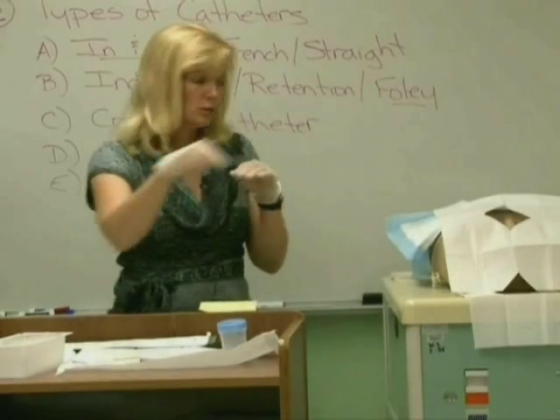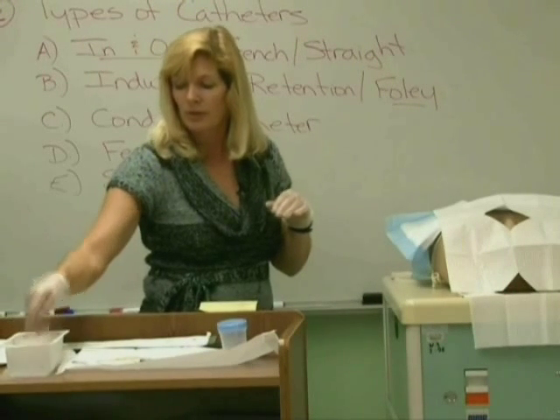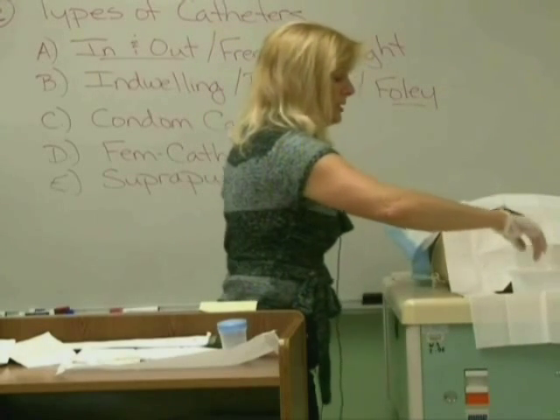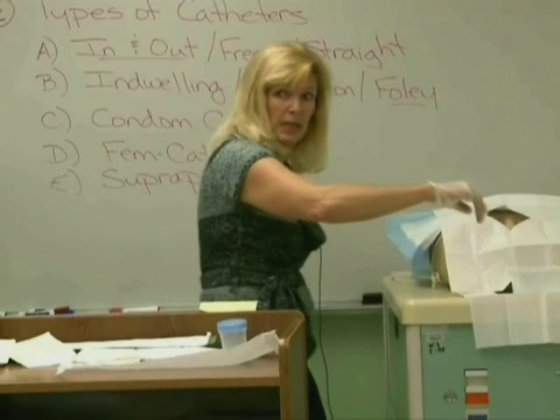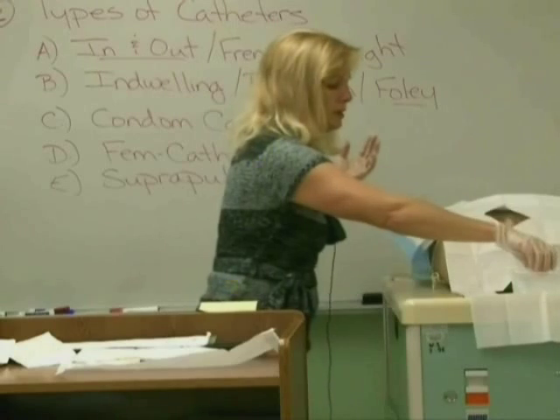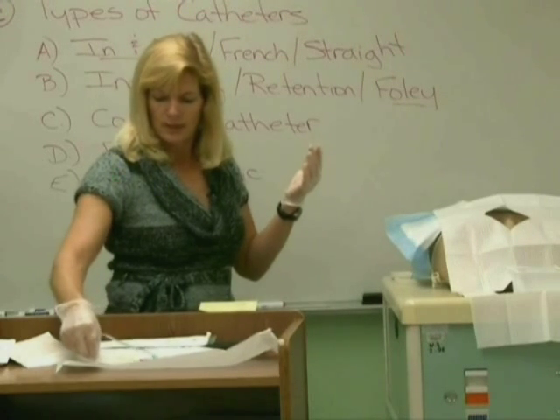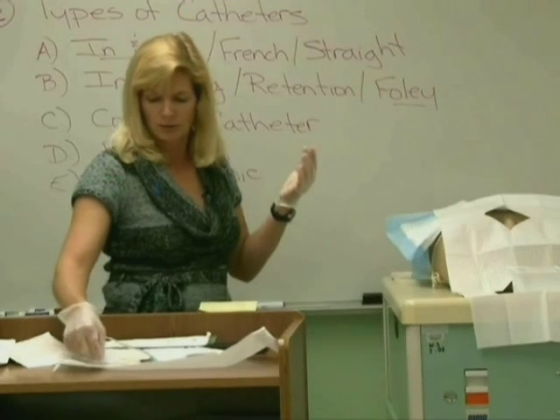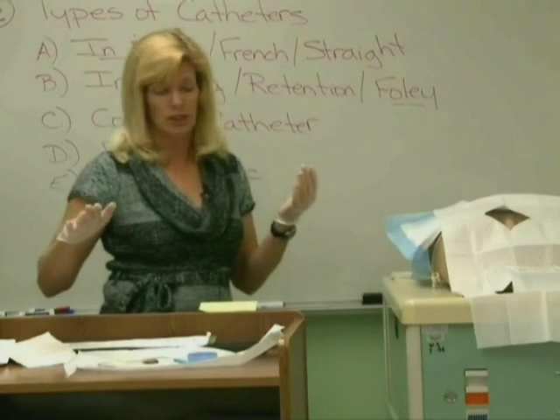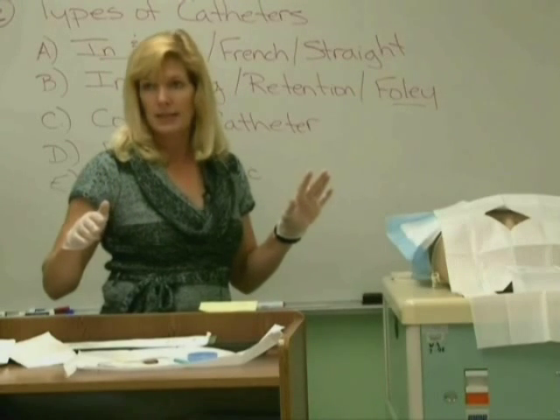Move your collection container between the legs to catch the urine. Put your sterile gloved fingers on the inside of the container — the inside is sterile; never touch the outside or the rim because it's dirty. Move it right in between the legs, keeping your hand up so it doesn't touch your pants or the bed. Both hands are still sterile. Get your cup close to catch your urine sample. Lubricate 5 to 7 inches on this catheter for a male — it's approximately 2 to 3 inches for a female. Lubricate generously.